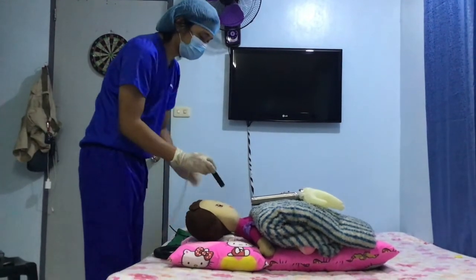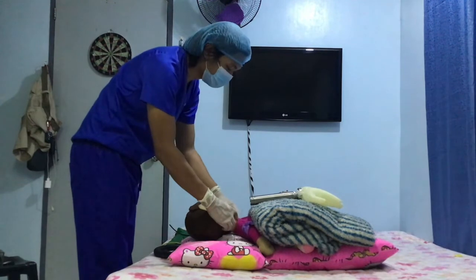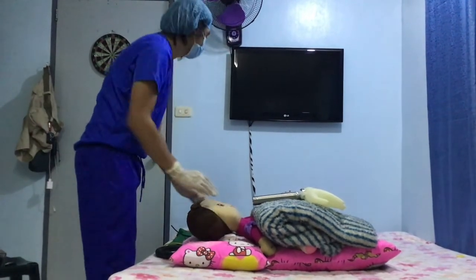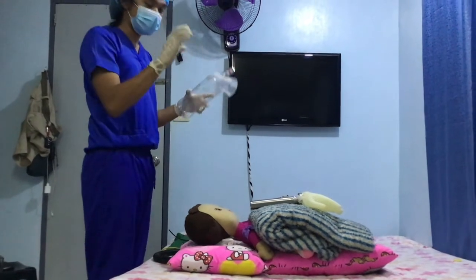Suction for any secretions or blood. Then, perform the jaw thrust maneuver to move the tongue anteriorly. Pre-oxygenate using the bag valve mask.